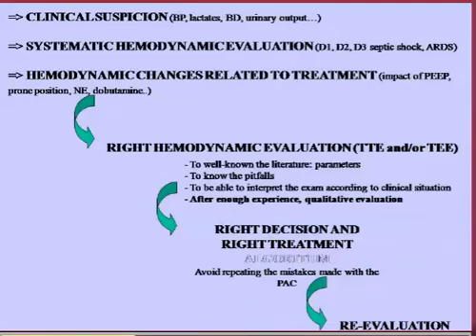Avoid repeating the mistakes made with the pulmonary artery catheter. You have a device, you do a hemodynamic evaluation, and you have in your mind the protocol and the change in treatment according to the evaluation. And so you can re-evaluate the patient after changing the treatment.